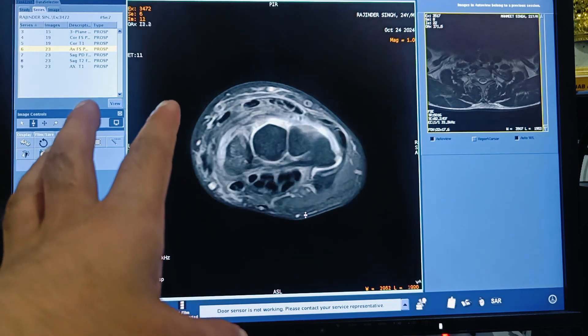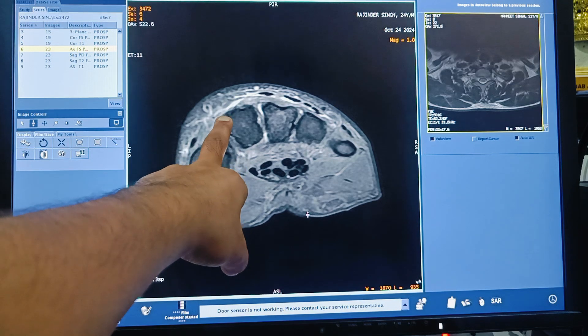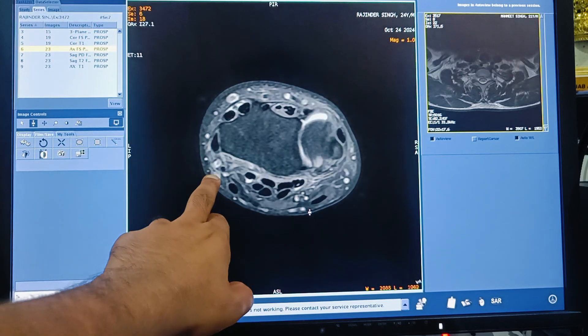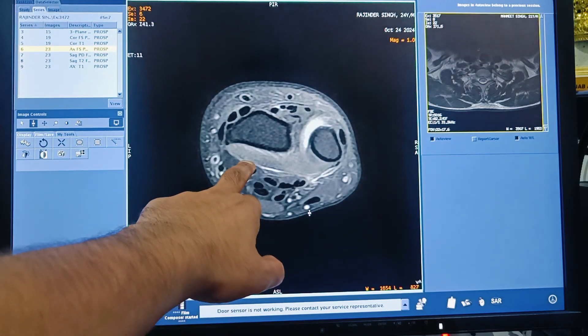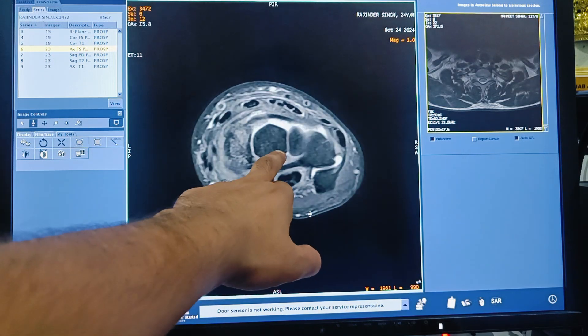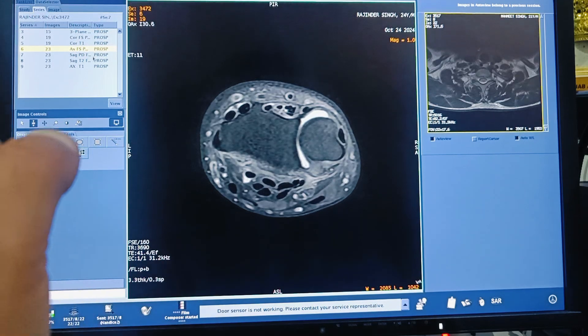After the coronal T1, the next sequence to acquire is the axial PD fat suppression sequence. The sequence is the same as the coronal PD fat sat, but the imaging plane is different — it is axial. This is the axial PD fat suppression sequence.